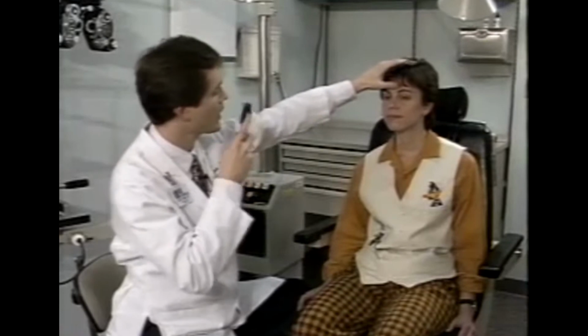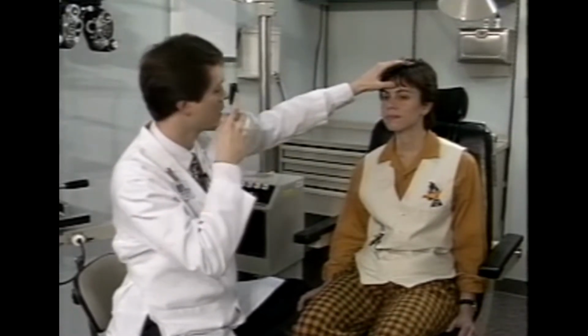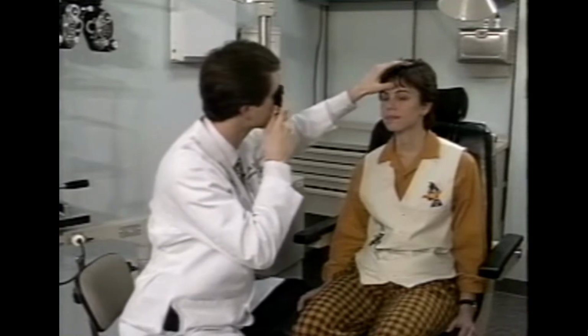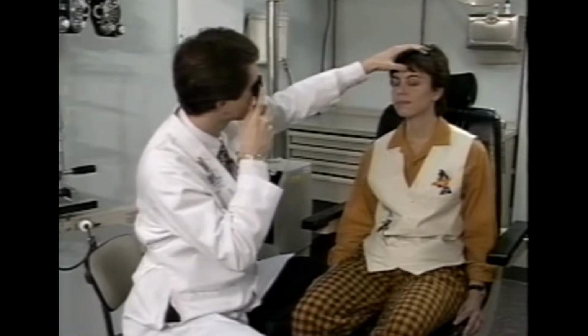I prefer to put my hand on my patient's forehead, both to stabilize their head and prevent me from bumping into them as I move closer. Next, move slowly closer to your patient's eye, keeping your red reflex directly in the center.